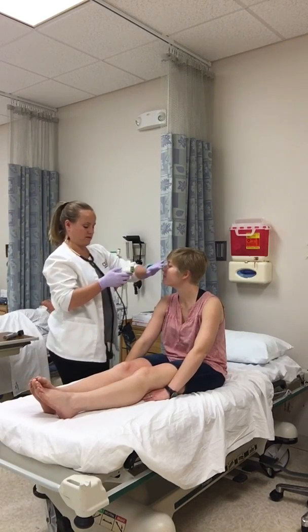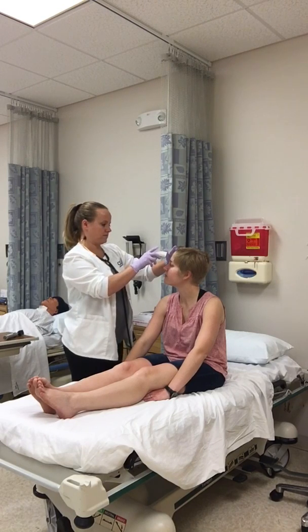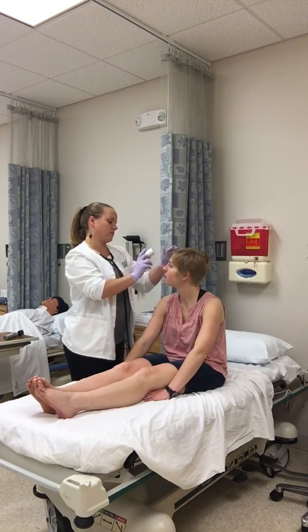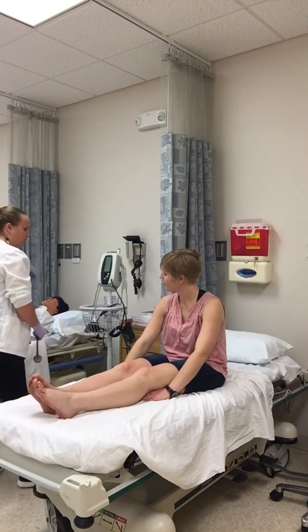I'm going to get your temperature. It's 98.3.